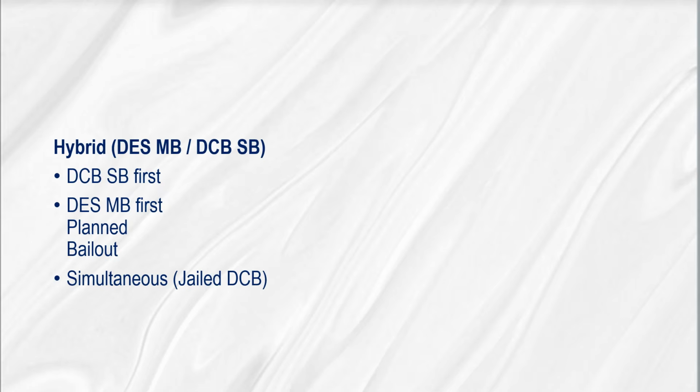Hybrid technique, DES in the main branch and drug-coated balloon in the side branch, includes dilatation of the side branch drug-coated balloon first, or DES in the main branch first, or simultaneous jailed drug-coated balloon technique.